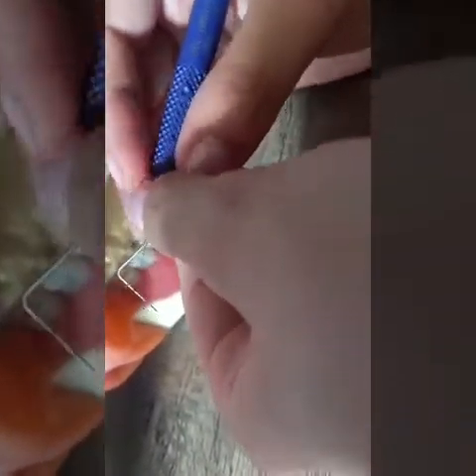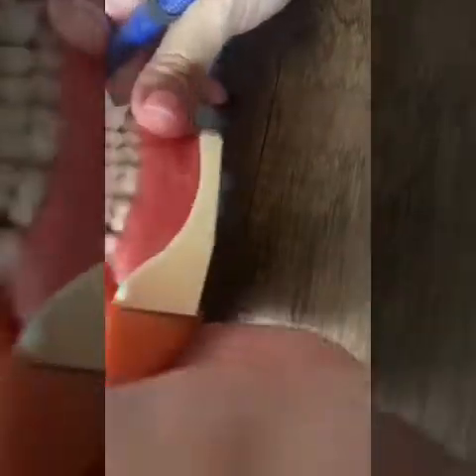The CAL, which is clinical attachment loss, is the distance between the CEJ and the junctional epithelium. The depth of the periodontal pocket is determined by measuring the distance from the gingival margin to the base of the sulcus. Each tooth has 6 sections, okay? So it's 6 measurements per tooth.